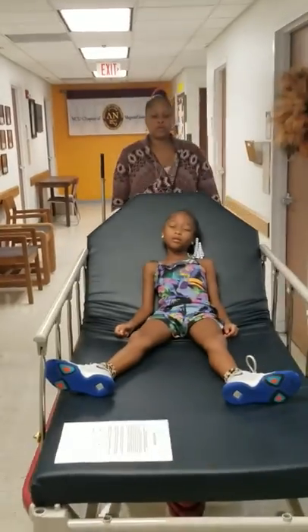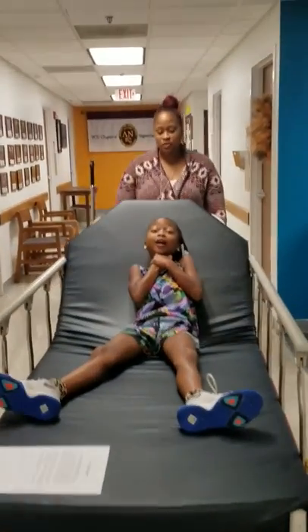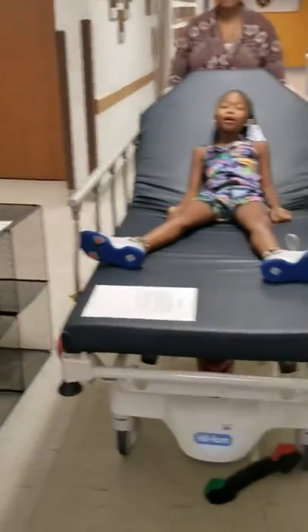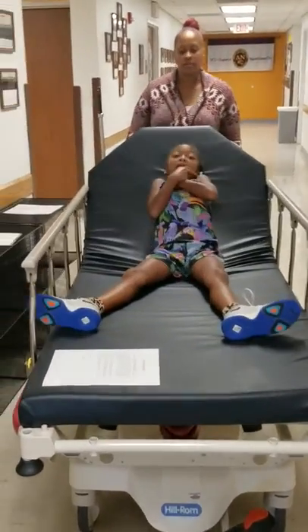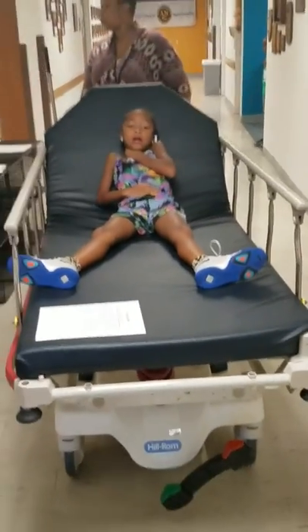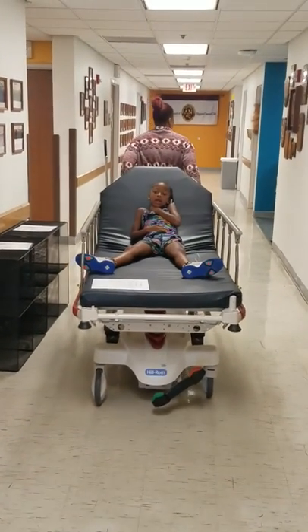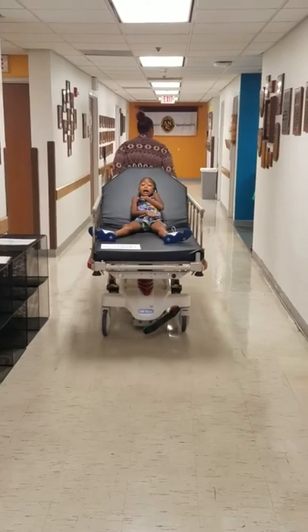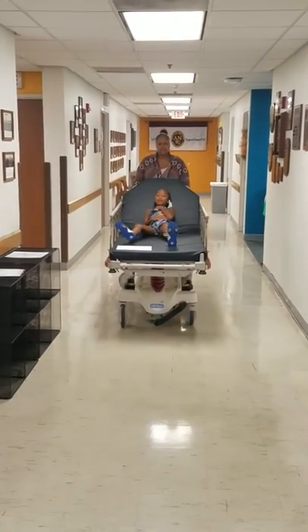As you're going along down the hallway, you always want to push the stretcher in a forward position so you can view the path in front of you and you can also see your patient. You never want to pull your stretcher backwards because you can't see your patient — your patient can easily fall off the stretcher and you would not know, or you can hit things that you can't see.